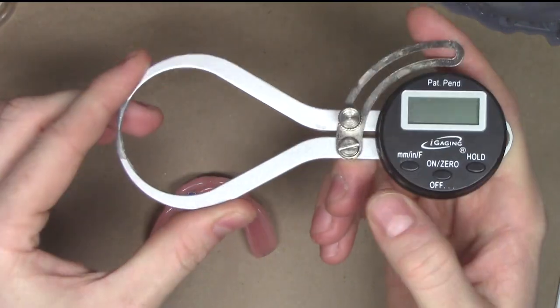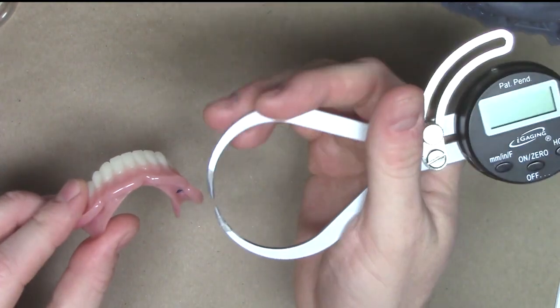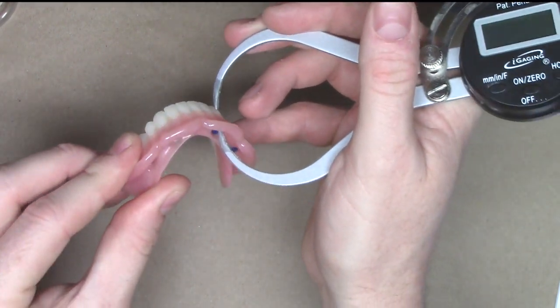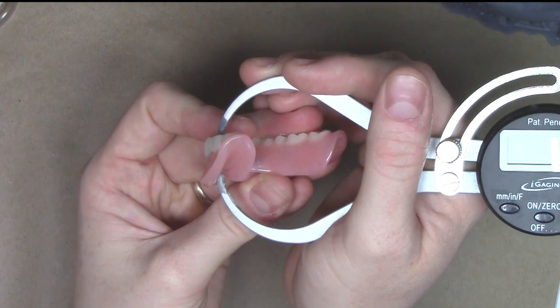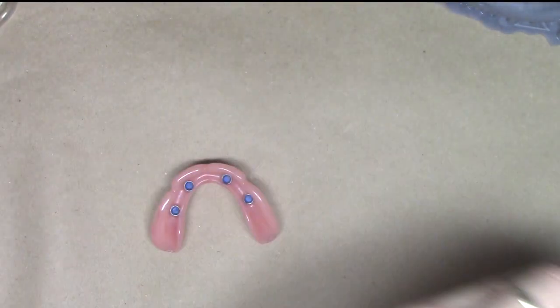You can order this just online. This is a little digital caliper, and unfortunately the batteries need to get replaced. But what you do is you take a digital caliper or a Boley gauge and you click it here to here, and it'll give you a diameter and a height. And this height, somewhere between 9 to 11 millimeters, is more than sufficient for overdenture stabilization.